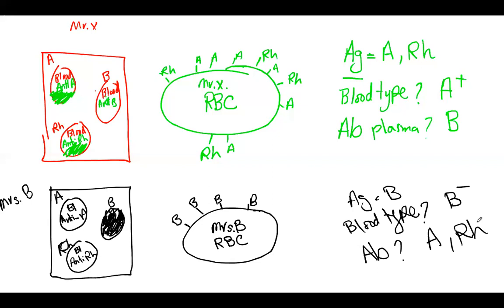So you have a video to watch, and this video has examples of 4 blood samples. These are synthetic blood samples as well. So I have run the experiment for you. What you will be looking at is trays of synthetic blood that is mixed with antibodies. Based on the changes you observe in the tray, you would carry out the same process that I've done here and identify the person's blood type based on the clumping that is visible in each of the wells for each of the samples.